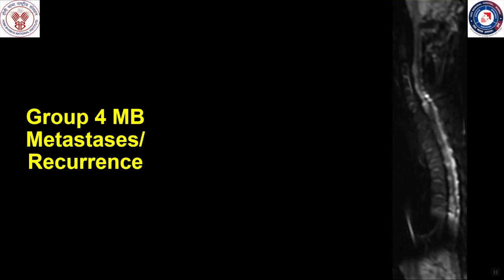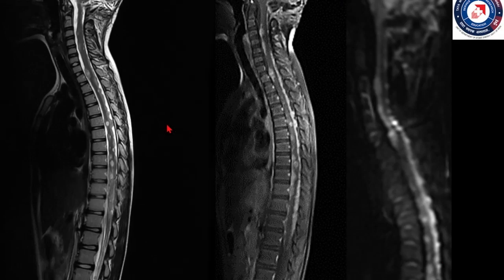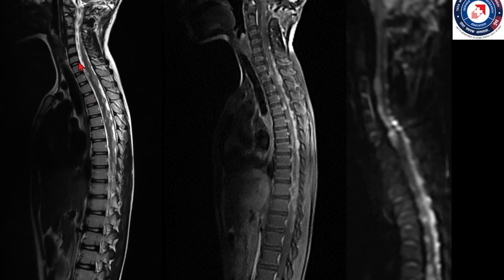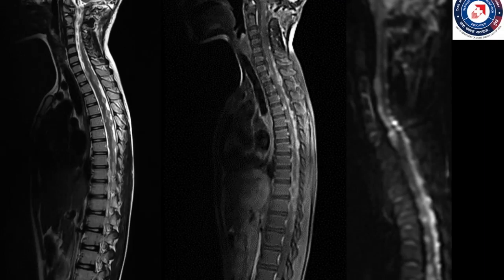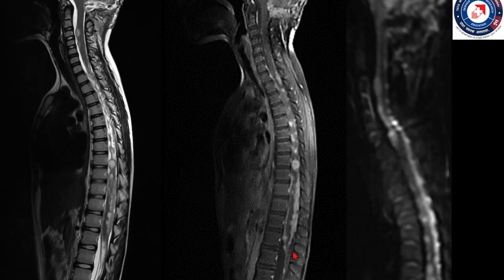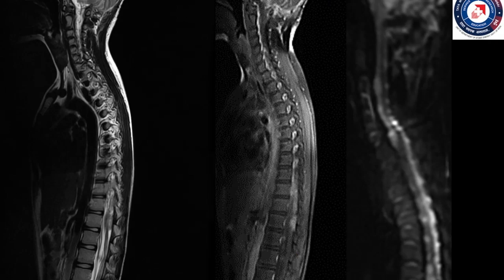On diffusion-weighted MRI of the spine of the same child, nodular areas of restricted diffusion are seen involving the entire length of the spinal cord. These lesions appear as nodular areas iso-intense to grey matter on the surface of the spinal cord and show post-contrast nodular enhancement, also involving the cauda equina nerve roots. Group 4 medulloblastoma metastases tend to be nodular, involving both the brain and spinal cord, and similar to the primary neoplasm, show restricted diffusion.